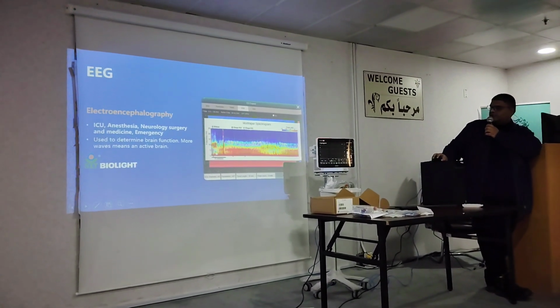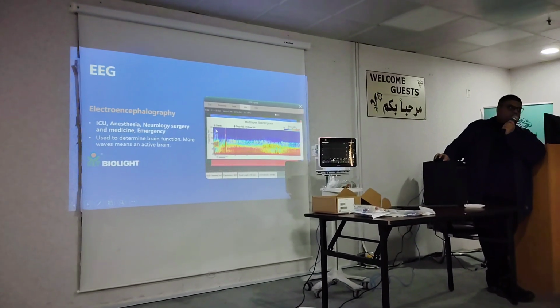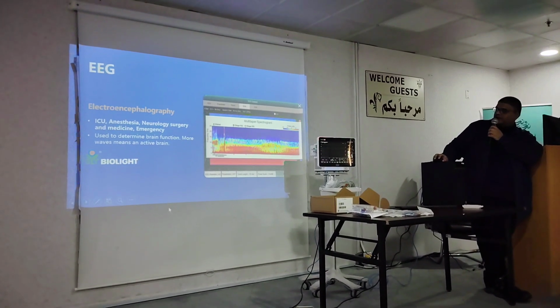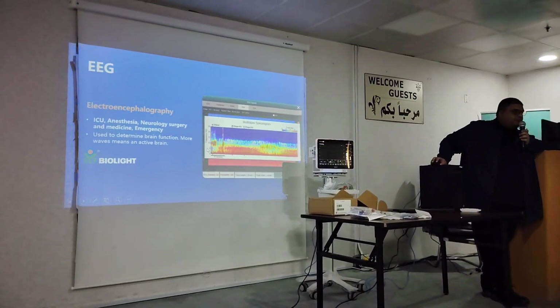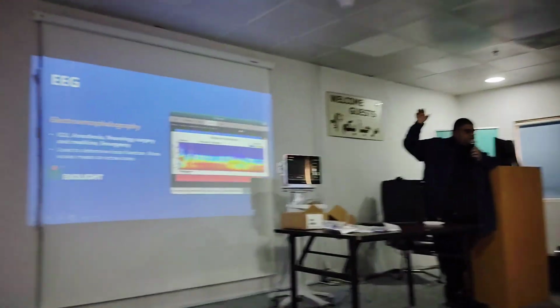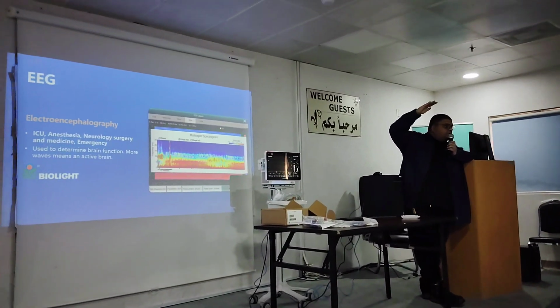So you see, in the first 5 minutes, we see a lot of alpha waves, and here we see the spectral edge frequency, which is closer to 25. If the spectral edge frequency is this high, and we have an alpha wave for the first 5 minutes, that means the patient is awake with their eyes closed. Between 15 to 25 is the beta wave frequency.